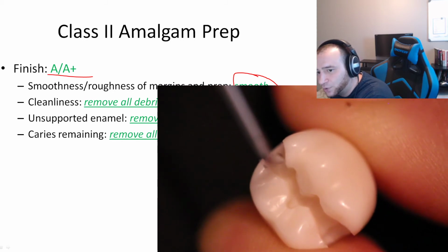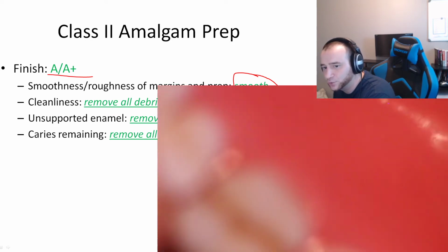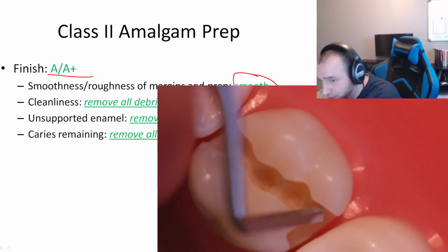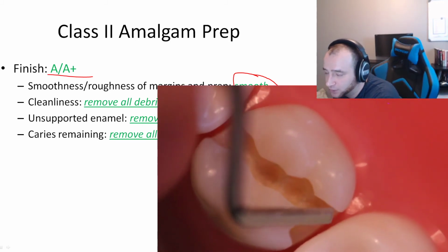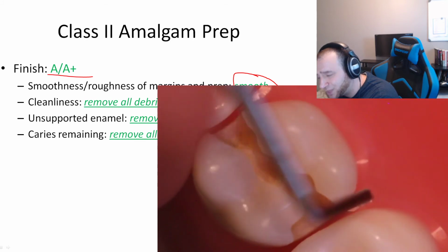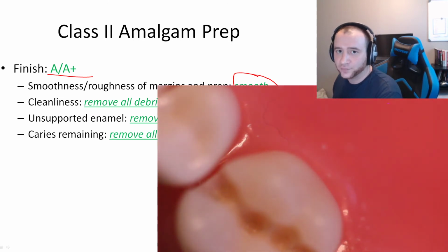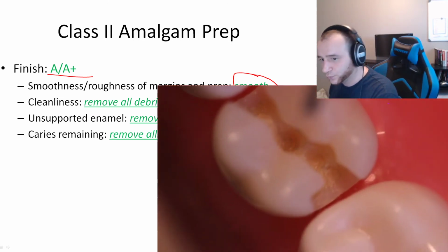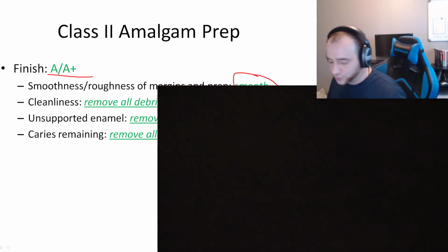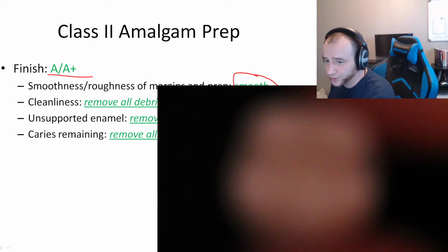The reason is it might work on plastic, but once you get to the Kilgore teeth, if you try to scratch out the unsupported enamel with a hatchet, what sometimes could happen is you could break the layer of enamel and cause unrepairable damage, right? This is not real enamel. More of the enamel will break off than you wanted, and then all of a sudden you're left with roughness or damage to the tooth that's not repairable. So don't use the hatchets to remove the unsupported enamel, especially in Kilgore teeth, even though it's working in plastic.